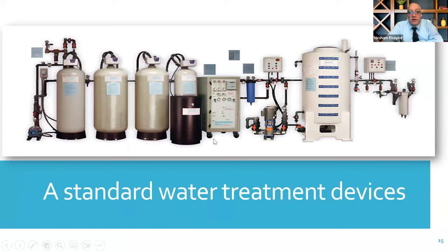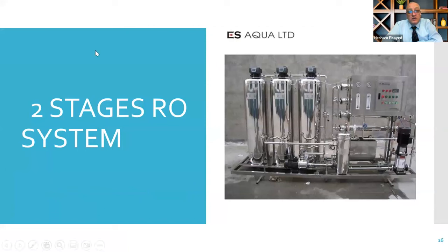The standard water components, which are common in most clinical centers, are composed of a sand filter, carbon filter, softener, bacterial filter and tank, and UV lamp. If you look at that, this could be harmful for patients on hemodiafiltration unless there is strict control of the water treatment and the endotoxin retention capacity is high. In the past, two-stage RO in series was used, so it could remove endotoxins and micromolecules more efficiently. That was about 20 years ago. Nowadays, we are not using double RO stages much because we have endotoxin retention filters in each dialysis machine.